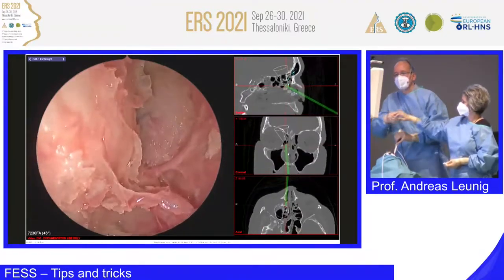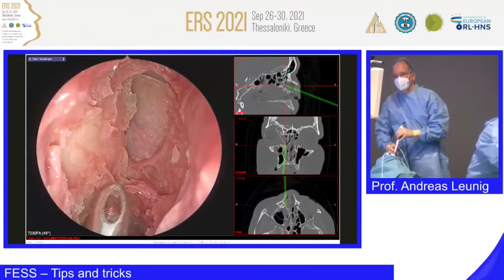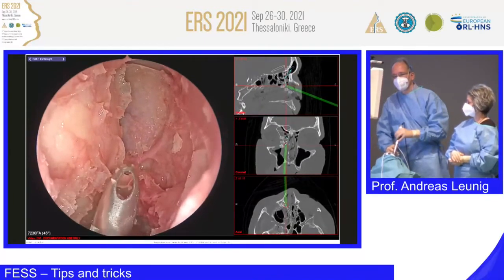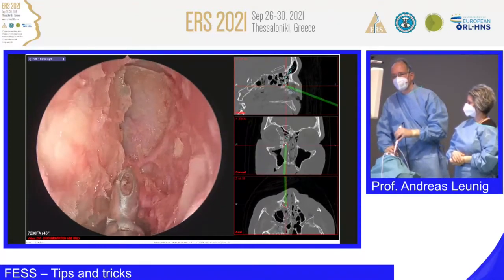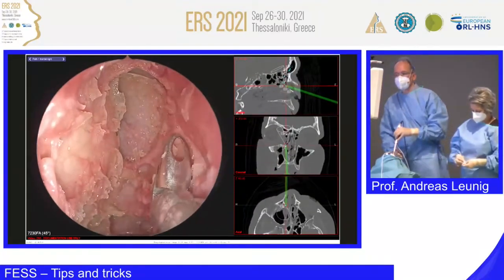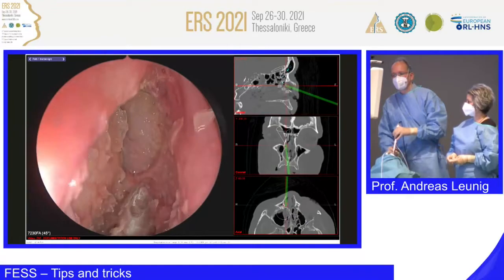Good, that's the last step in making a complete frontosphenoethmoidectomy. There are some tiny bony lamellas. Usually we would take them out like this here. And pay attention here, that's the artery.